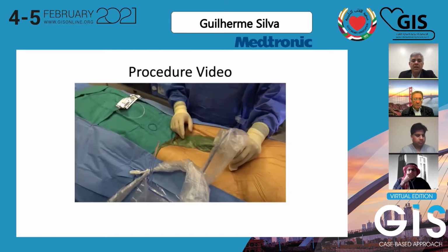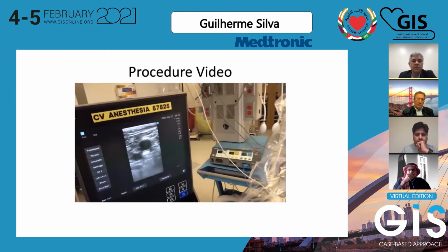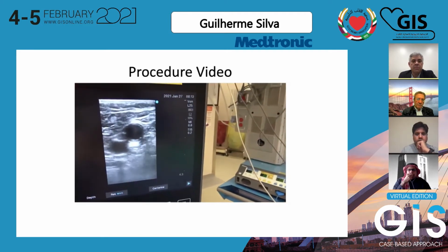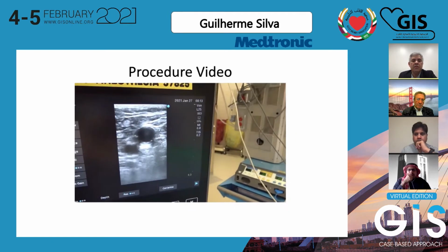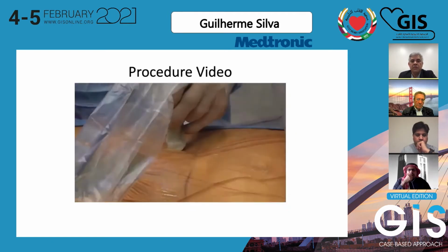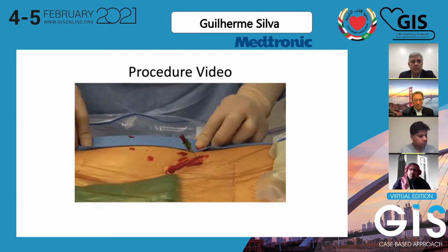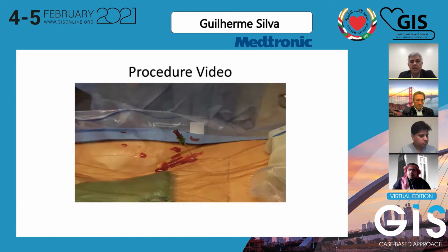As we heard from the previous panelists in the presentation, we do the same. We have a very careful examination under CT of the access site. We do put in a pacemaker routinely, especially for core valves, and we decided that this patient would be better with a supra-annular valve. So we get access here.